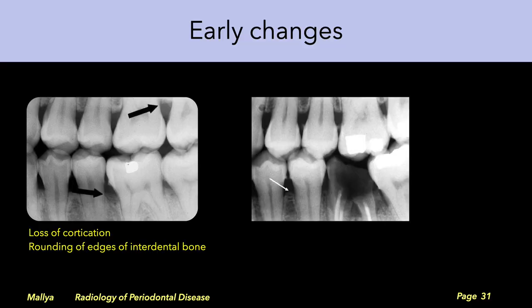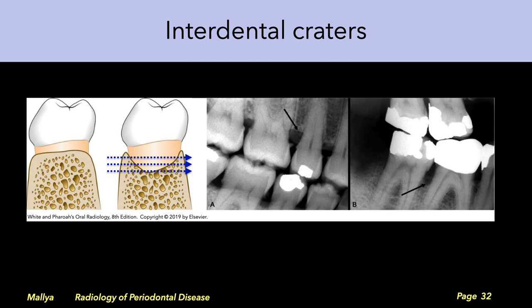The earliest changes of periodontal disease will start at the interdental bone. You will notice a loss of cortication of the interdental bone and the edges of the interdental bone start to get rounded off with widening of the periodontal ligament space. In the initial phases of bone loss, there is a crater-like defect in the interdental bone, leaving the facial and the lingual plates intact. These plates absorb adequate photons to appear radiopaque and mask the underlying crater defect.